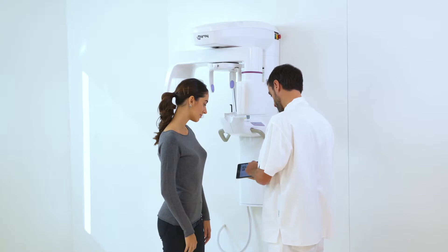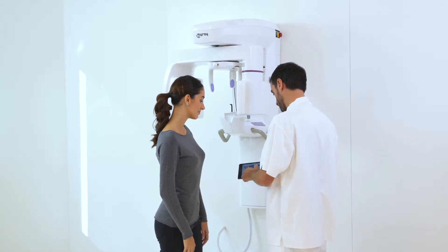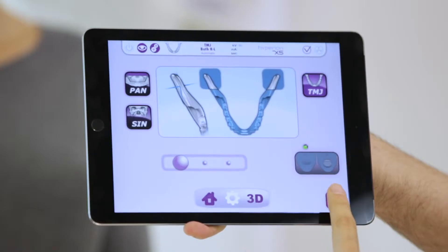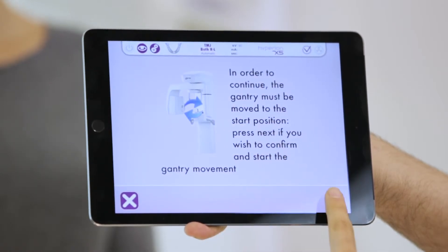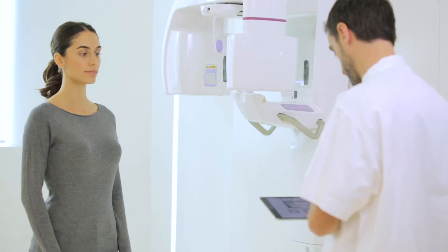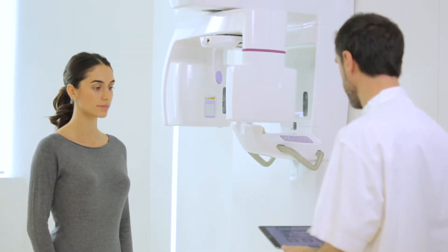Once the desired examination has been selected, the patient must be positioned. First of all, press the key and wait for the X-ray unit to reach the initial position.